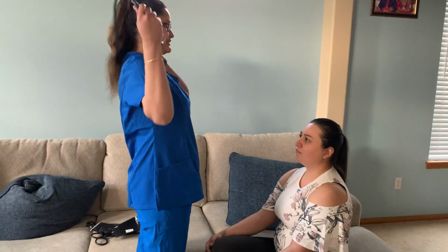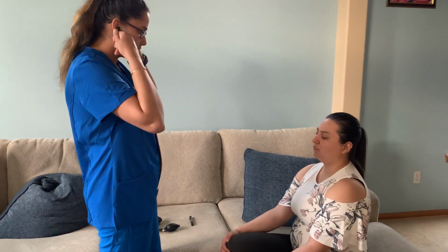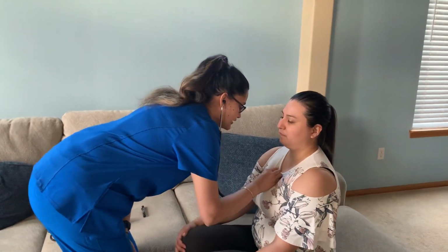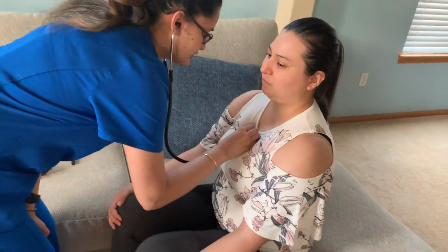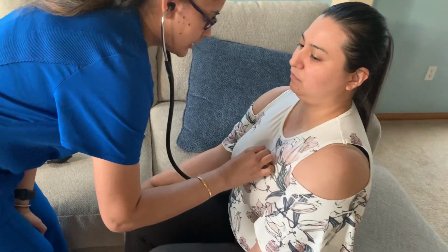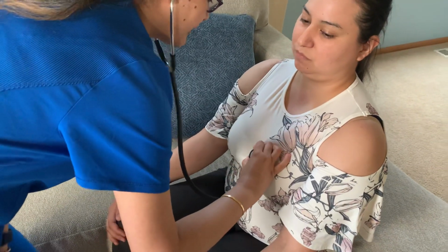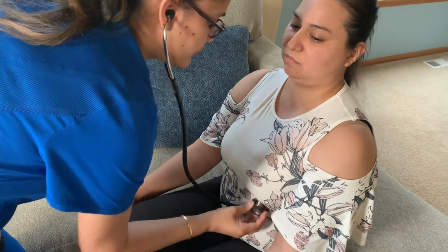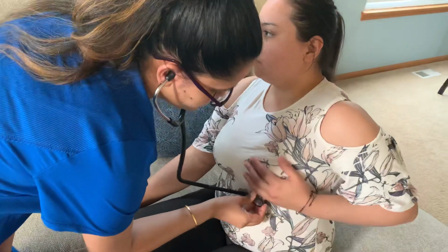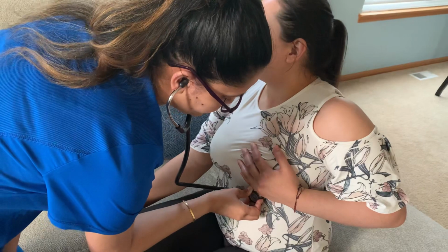Next, I'm going to listen to your heart, your cardiac landmarks. Aortic valve, pulmonary valve, Erb's point, tricuspid valve, mitral valve, and I'm also going to hear the mitral valve, which is the point of maximal impulse. I'm going to listen for 1 full minute.